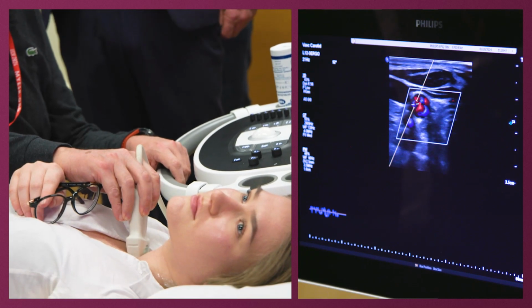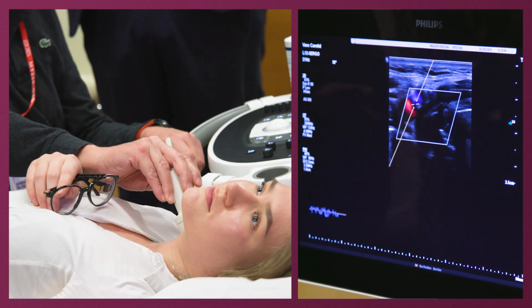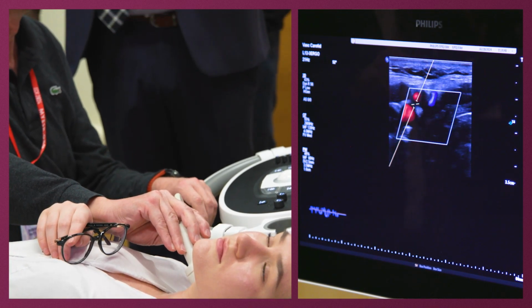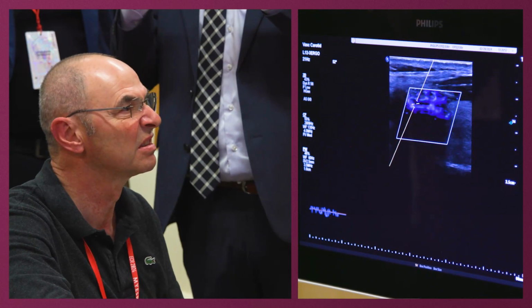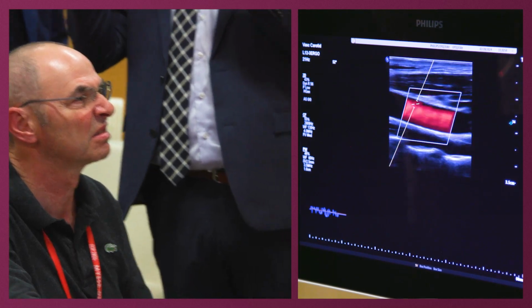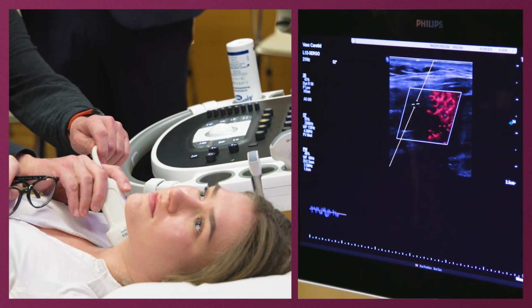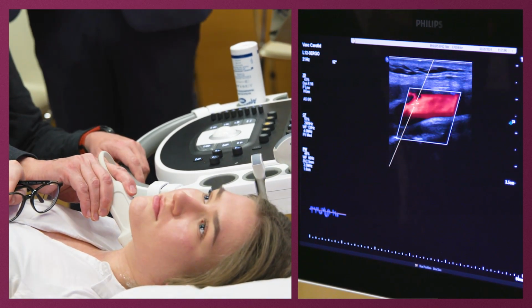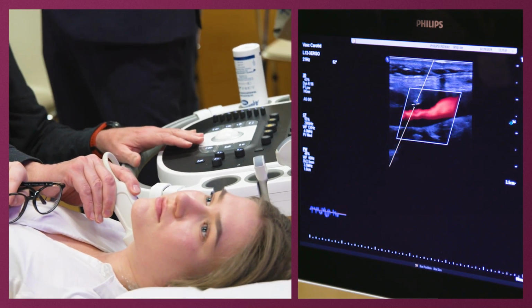external. You don't need to save any. You don't need to make any measurements. You just need to show on the image that this is the external, because you can see the tapping or you can see a side branch, and you label it external. And then you go to the internal, and you find the highest velocity, and save that, measure that, and then you go proximal, if it's possible, and see if you can get a normal velocity.